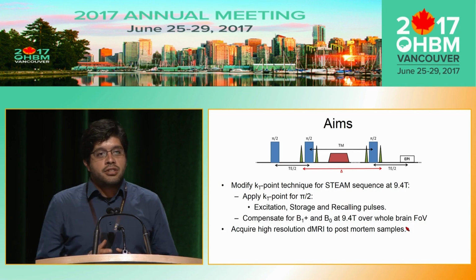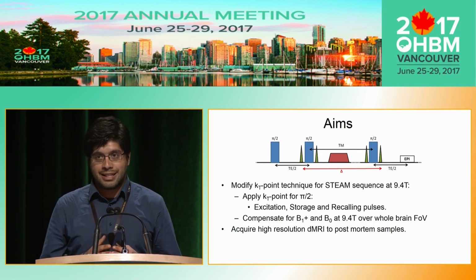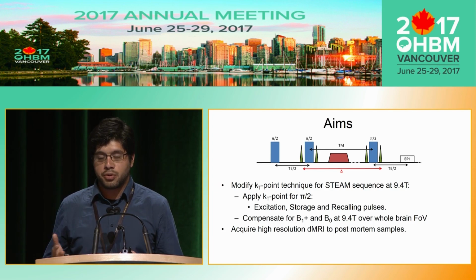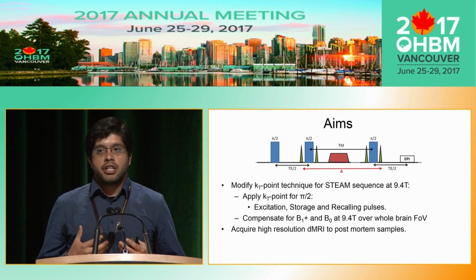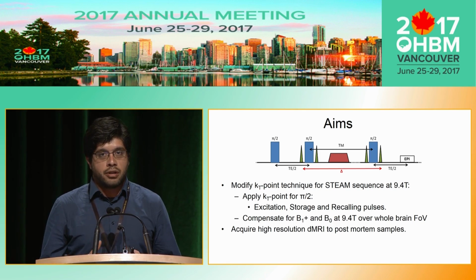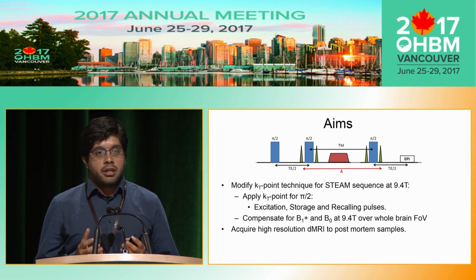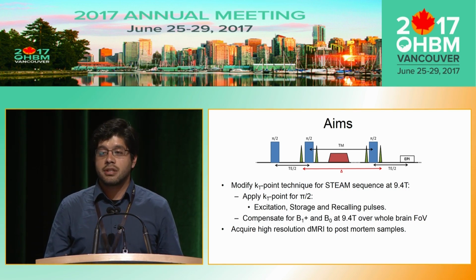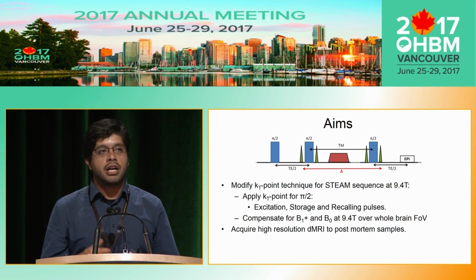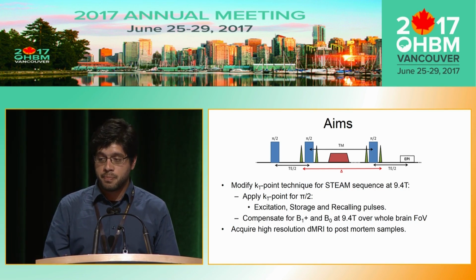So the aim of this study is to try to extend the use of this method to the STEAM sequence, which is composed of 3 pulses, to make this compensation and recover the signal dropout that we can see in our data. And if we can incorporate these pulses in our sequence, then we can move forward and try to acquire high-resolution diffusion data in post-mortem samples.